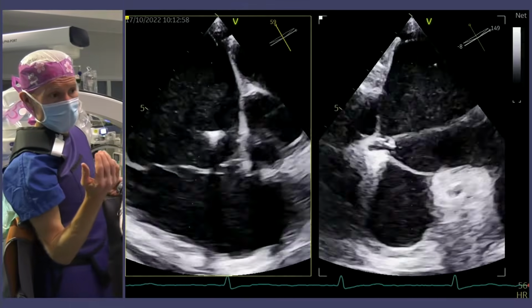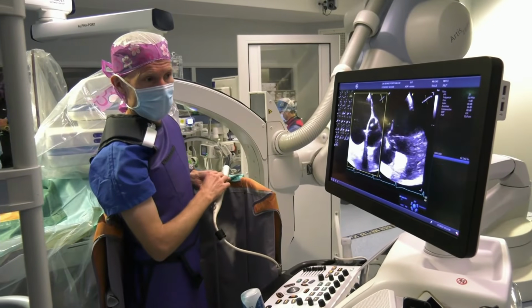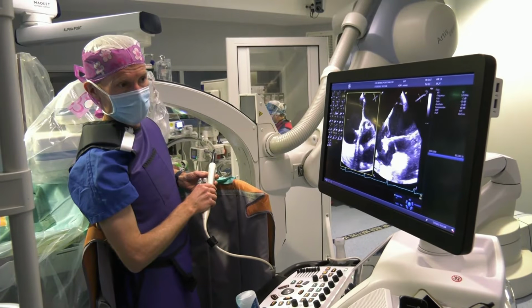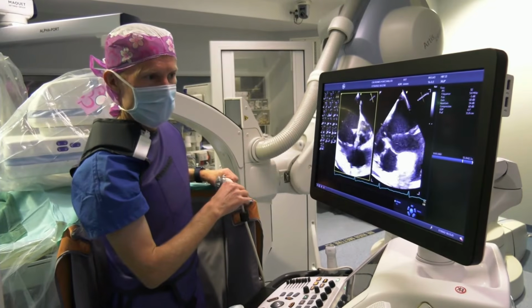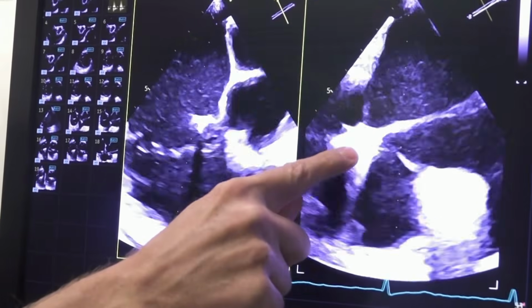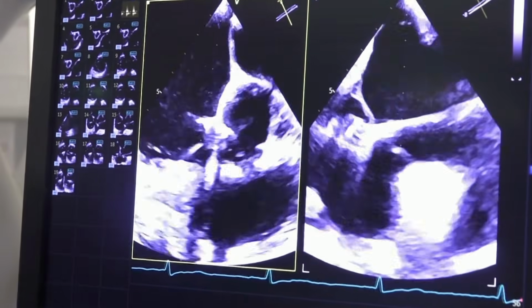We are not too close to the commissure. We just check with the transgastric view. We are really in the mid part of the septal leaflet, so it's exactly where we want to be. And we will see if we can grasp both leaflets in that position. So you see that we have correctly the septal and the anterior leaflet, then we decide to grasp, and you see that we are just grasping, and we have perfectly the septal and the anterior leaflet between both arms. So it seems that we really catch both leaflets properly during the same grasping.